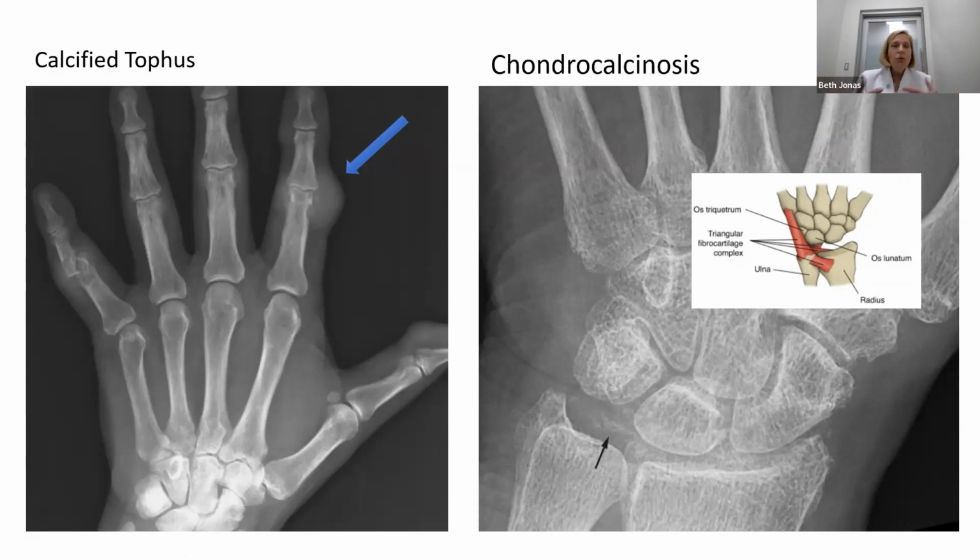Like if you have a patient who's got polyarticular inflammatory arthritis in the hand, rheumatoid factor is negative, CCP is negative, there's really nothing else going on that makes you think about rheumatoid, and you see that, then it's more likely to be CPPD arthropathy. So those particular radiographic features can help you make a diagnosis.